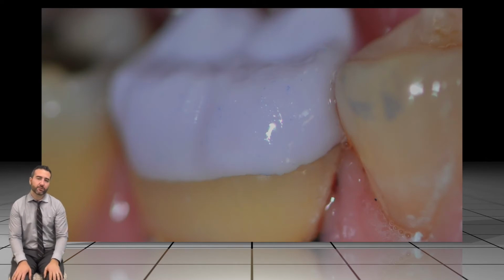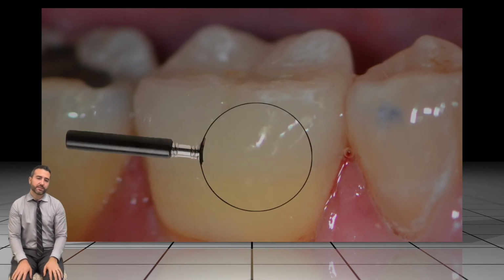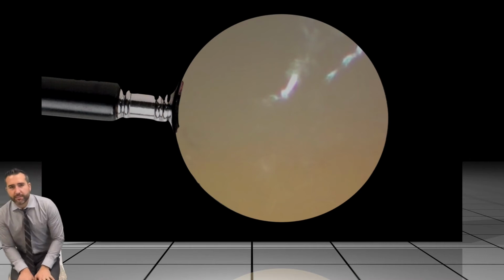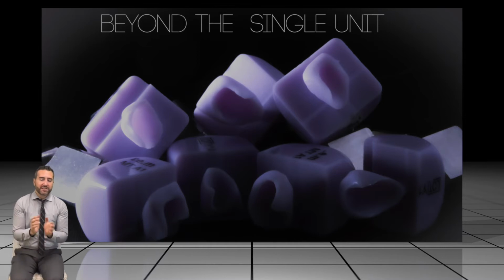Here's a case with an occlusal overlay or a crown lay. And once you bond this on, in this case, this is Emax, you can't see the finish line. It completely disappears within the tooth. And I was able to preserve something called the biorim of the tooth. For all you biomimetic guys, you will understand what that is. It's really cool to be able to bring that service to my patients and not have to be aggressive with tooth reduction and prep for a temporary.